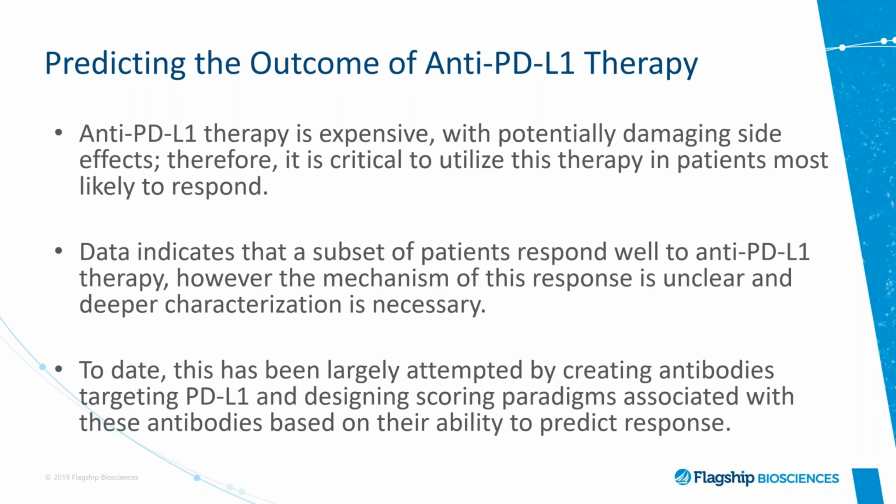Predicting the outcome of anti-PD-L1 therapy is very important because anti-PD-L1 therapy is expensive. It has potentially damaging side effects, mostly autoimmune disease, and therefore it's critical to utilize this therapy in patients most likely to benefit from it.